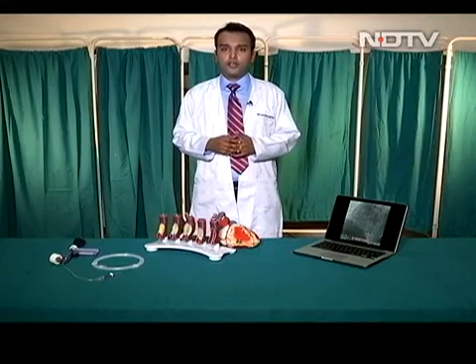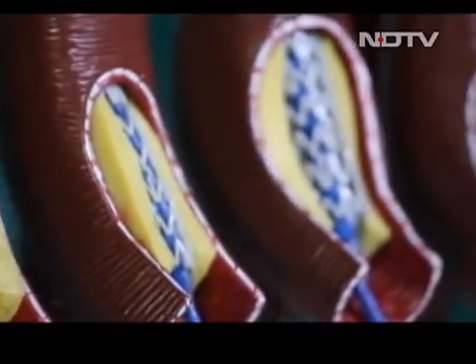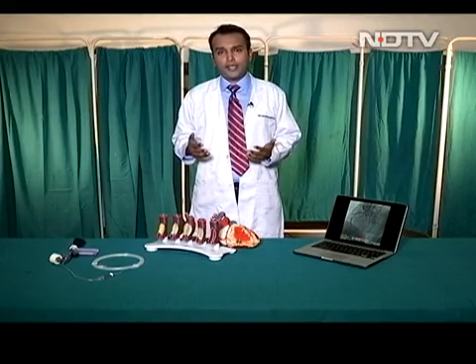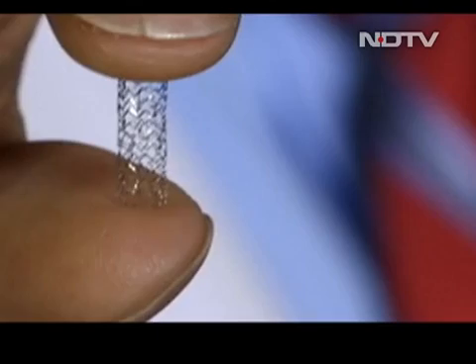Now, back in the 1970s, when my father was trained to be a cardiologist, the only way to open up blocked arteries was medicines. But in the late 90s and early 2000s, when stents were developed, this was a medical breakthrough. We now had a way to open up blocked arteries. Patients could not only feel better, they also started living longer.